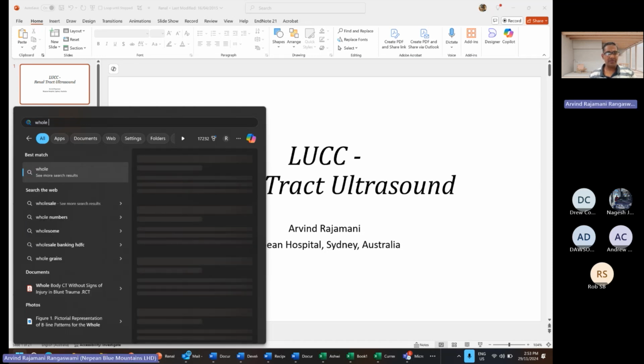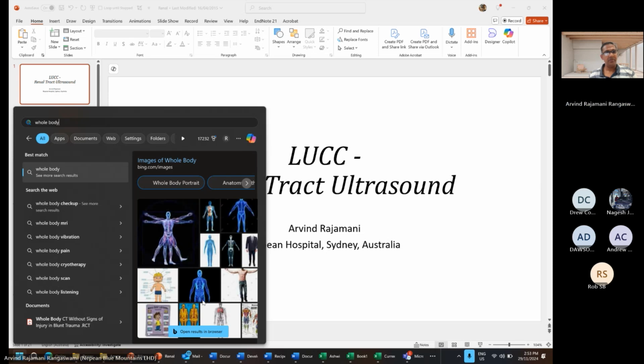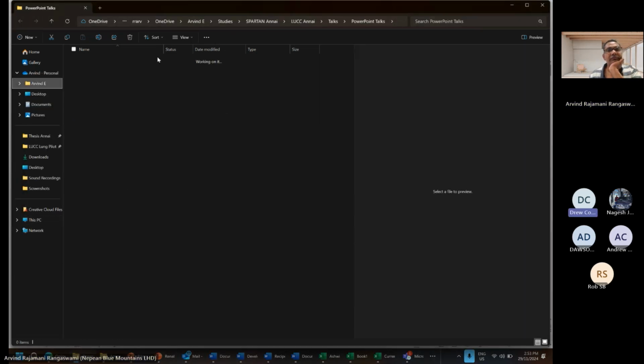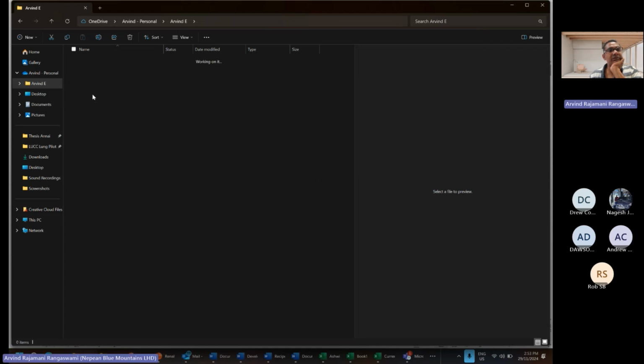Whole body ultrasound. Where is that? It's written by Lichtenstein, and there's imaging.